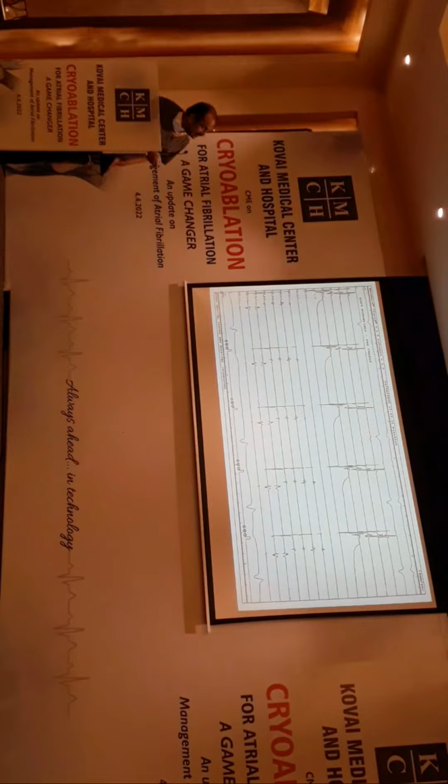So again, we are going into the right superior pulmonary vein. When you go into the right superior pulmonary vein, we are again seeing a pulmonary vein potential. One thing you can see here is there are two pacings I am doing. One is I am pacing from the coronary sinus. Another, there is a spike here. This pacing is done from the SVC.